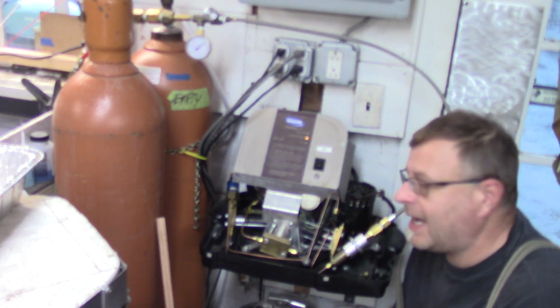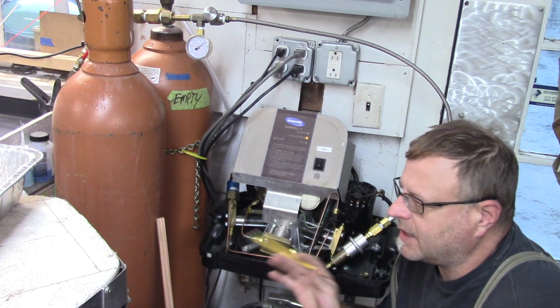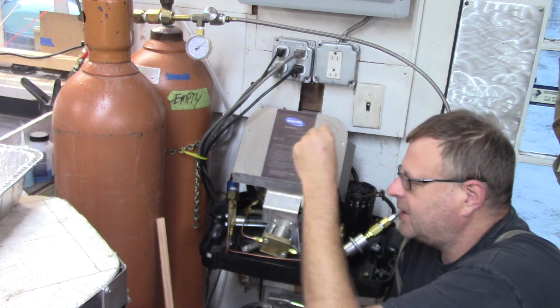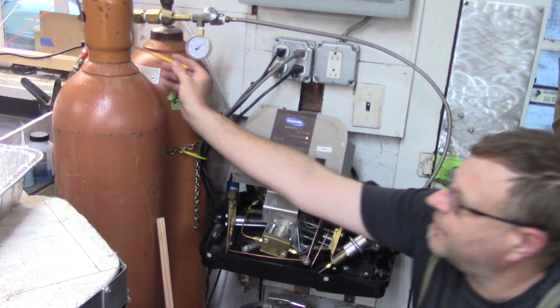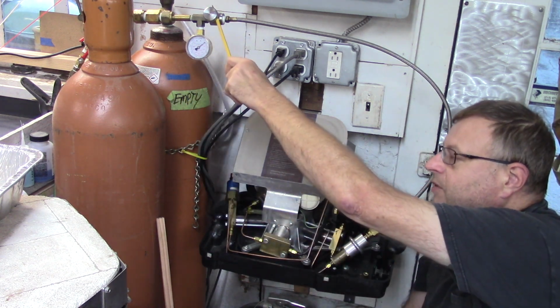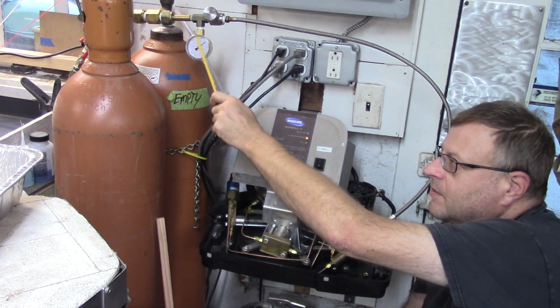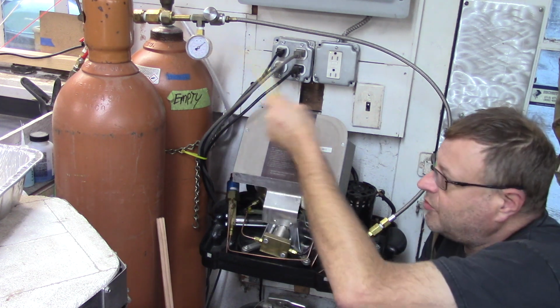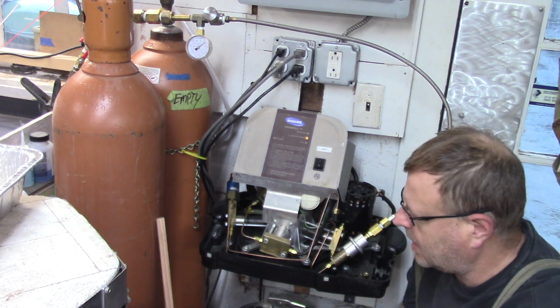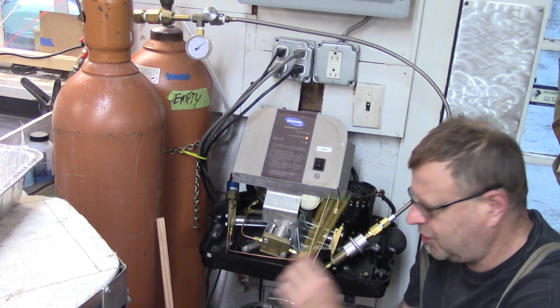Okay, so you'll hear that I have everything up and running. Right now I'm warming up the system because I want to run it to explain exactly what I'm fairly sure is going on here. The electronic wizardry inside of this machine is waiting until it gets enough oxygen pressure and purity to start the compressor. Now, in my other video I explained that I have a pressure relief valve in line here with the whip hose. I've released all the pressure to the tank, and the tank is turned off, so there's no pressure in this whip hose. I use the whip hose to see whether or not I'm building pressure, and this machine will build pressure. As a matter of fact, hopefully I'll yammer on long enough, or I'll just edit it out, to show that it's building pressure and what happens.